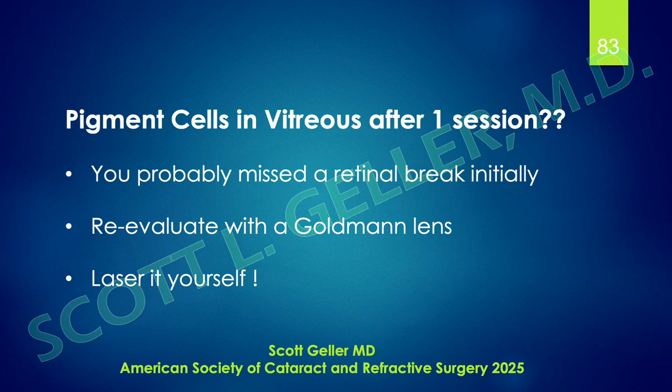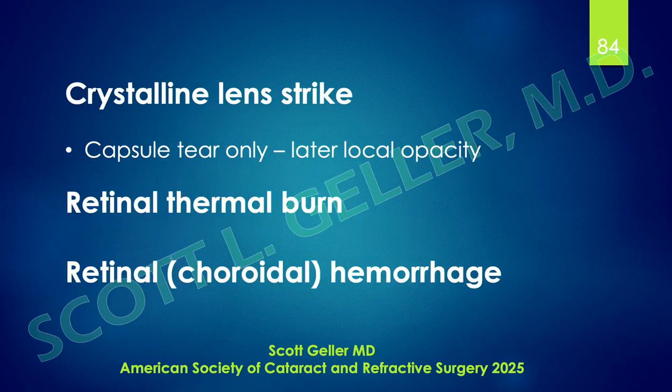Just be fastidious about it. So, crystalline lens strike, this is serious stuff. I've only seen 2 patients in my career with a crystalline lens strike. It was not an actual strike on the lens itself. I think the shock wave caused a tear in the posterior capsule. Interestingly enough, when I had this capsule tear, I sort of took a deep breath. This was when I first started doing lasers.